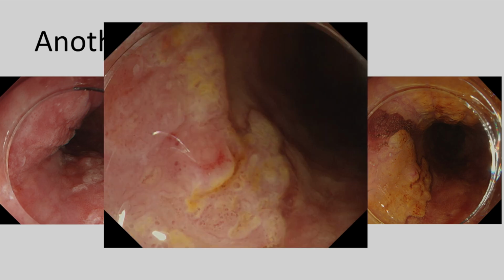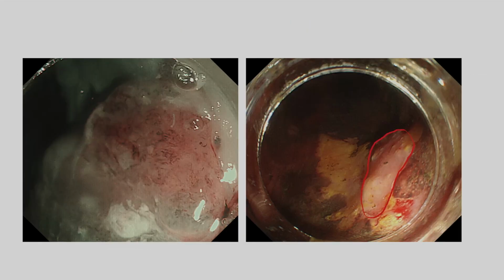Now, that's a close-up of that area. That is a barn door cancer until proven otherwise. Try not to resect this one. Whereas here is another case of pink sign, which again shows that this should not be touched. So try not to do ESDs in these kinds of areas. Lugol's is taken up nicely here. It's brightened up, but this area is completely pink. So that's a pink sign that you read.